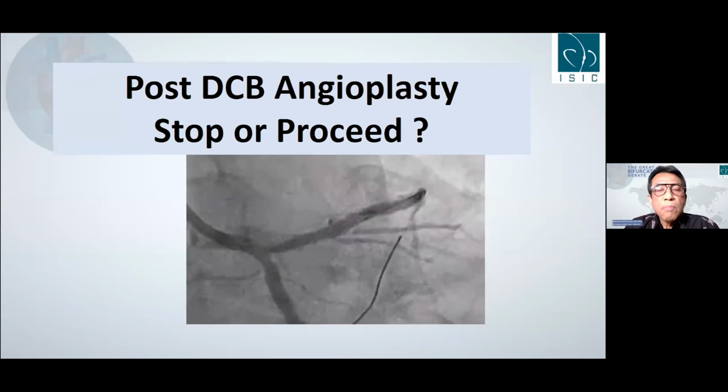One, stent towards the circ and then do kissing. The other one, as Dr. Kinoshita said, stent the left main and then open struts towards the circ. But definitely leaving floating struts, in my view, is not the best strategy at the moment.